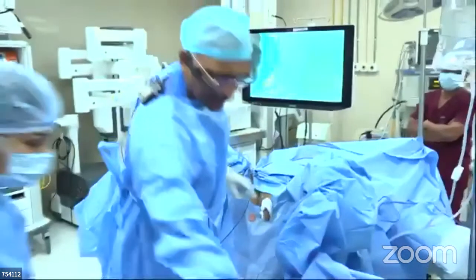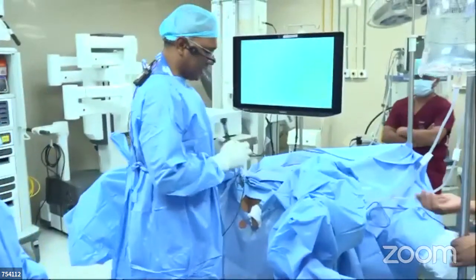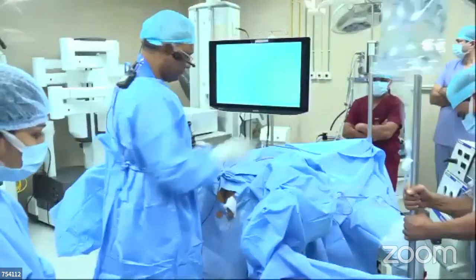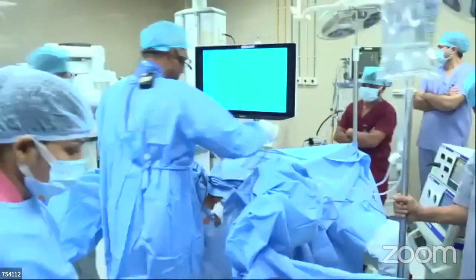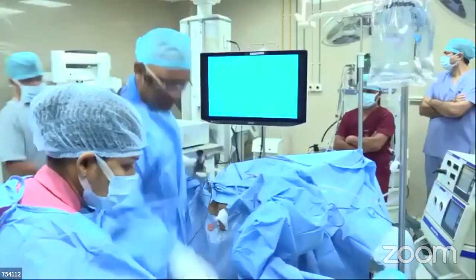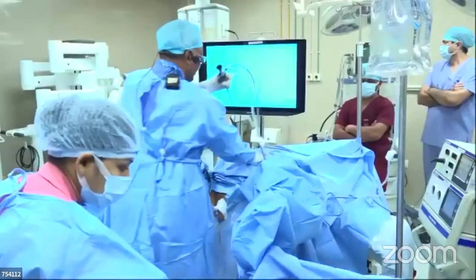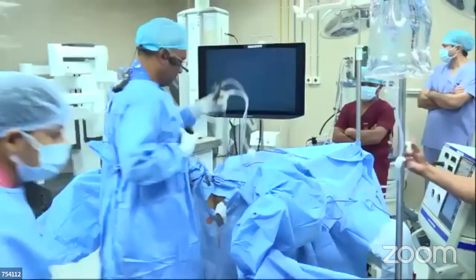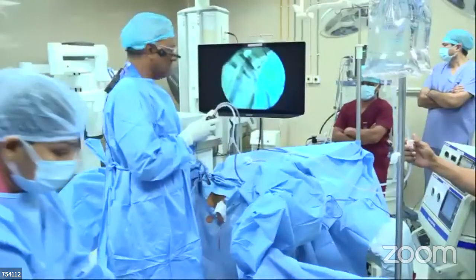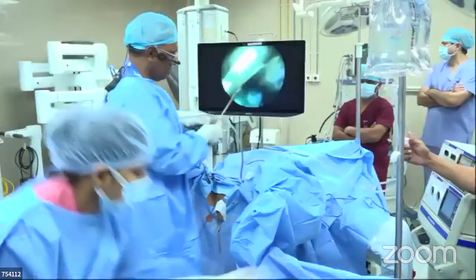No, yeah, I agree. Mallikarjun, can I make a comment, please? Sir, please, go ahead, sir. Mallikarjun, I agree with what you have said, but let me give you our experience, how we have learned from Dr. Mansingh. He will always like to do a cystoscopy, and it takes only 2-3 minutes extra. You can do a cystoscopy, you know about the urethra, you know about any intravesical pathology, and the prostate evaluation can also be done at the same time.